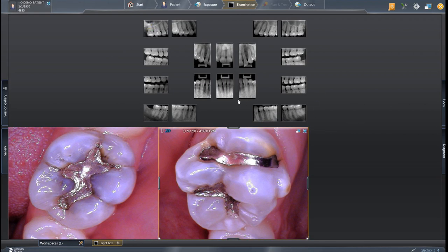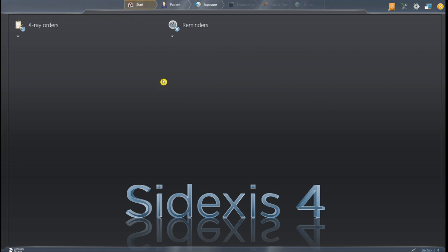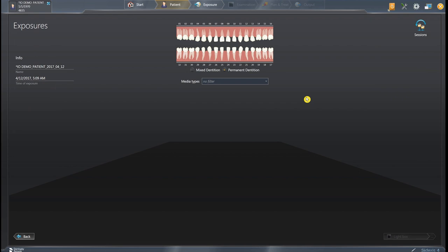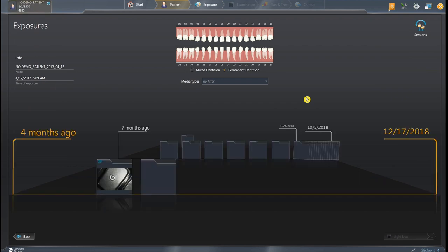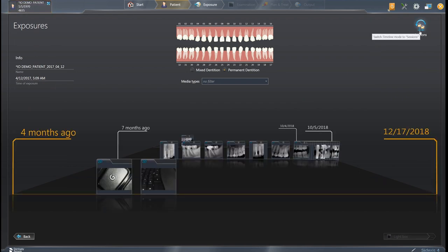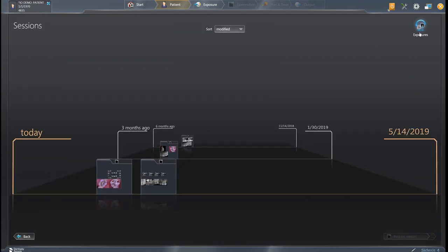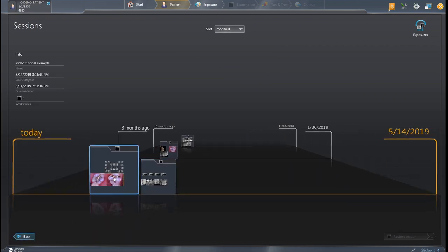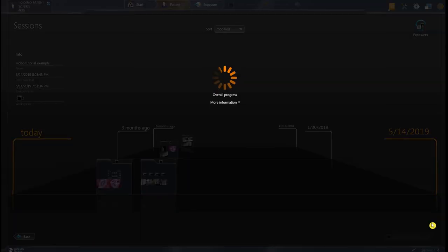If you close the patient out and want to pull that session up again without having to reopen the FMX and re-add each image, go back to the patient — IO demo patient — on the timeline. In the upper right-hand corner click Sessions, and you'll see all sessions saved for that patient. Double-click on the session to open the entire light box with exactly the images you had saved.